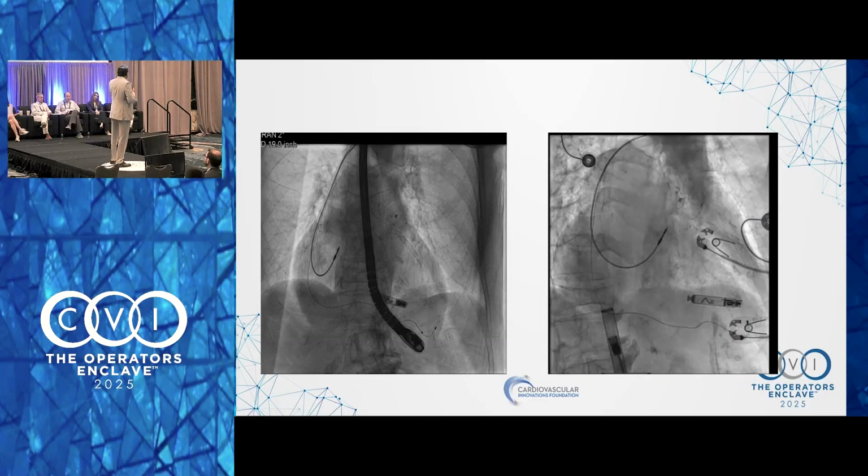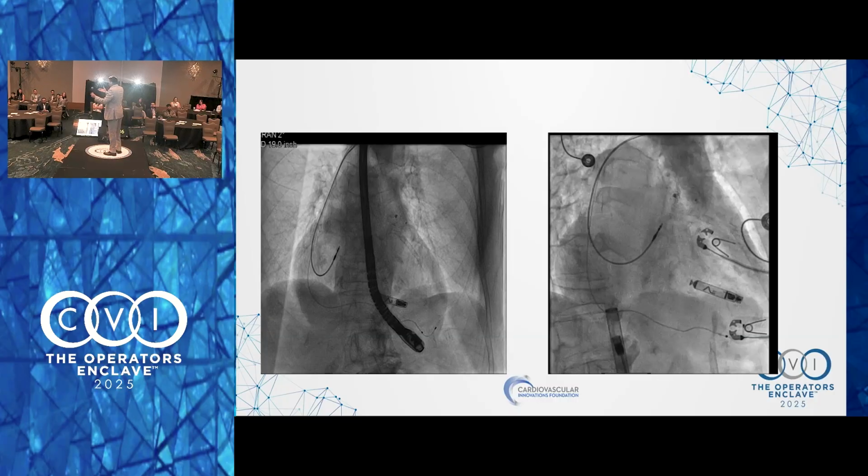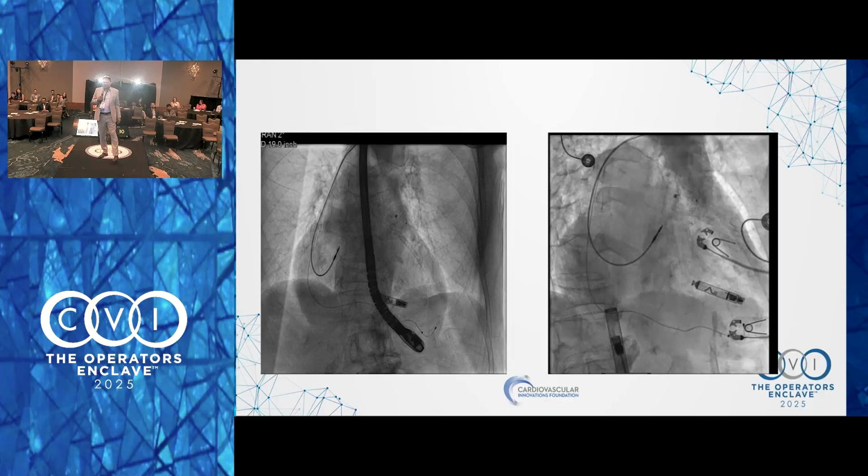Hursh, have you seen this? You would be interested in this. I'm really interested right now. I think we all are. The mechanism of how these guys manipulate this pacemaker is fascinating. The engineering that they've used to snare it, then orient that knob. You can see the knob there. They orient it onto this device, and then it screws in. I mean, if we had that on clips. One nice thing about this device in comparison to the Micra is that it's designed to be removed if needed. This was my first time doing it, so it's obviously very teachable if I'm doing it.